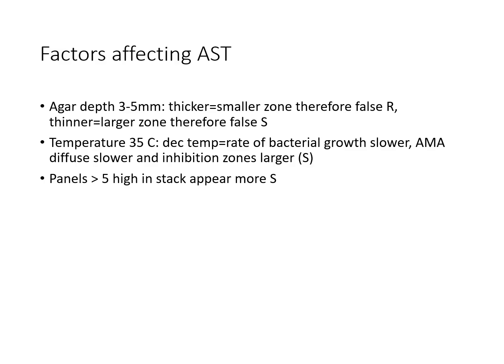Temperature should be at 35 degrees Celsius. A decreased temperature could result in slower bacterial growth, slower antimicrobial diffusion, and larger inhibition zones, which could lead to false susceptibility. For stacking of panels, when more than 5 panels are stacked, it can cause results to appear more susceptible.